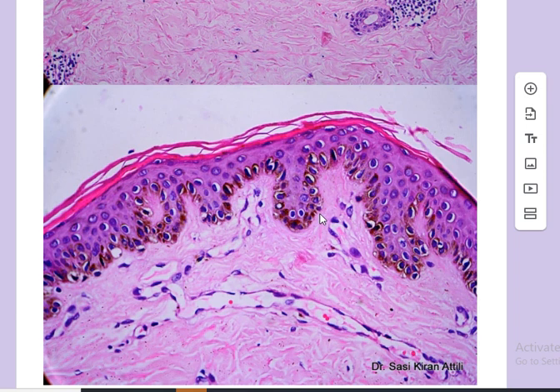You see these funny bits sometimes in biopsies, which makes your reading interesting. What you're seeing here are these keratinocytes which have a paler halo around them. Now we see this quite often in a number of biopsies, even normally. These are not melanocytes. Melanocytes are these spindly shaped cells, dendritic cells with a perinuclear halo. When you're seeing more rounded cells with a halo around them, this is just more of a processing artifact. It does not mean anything.